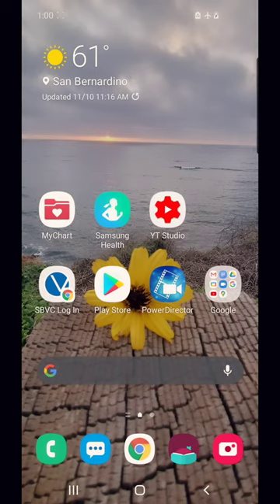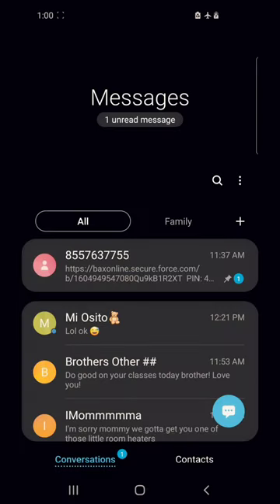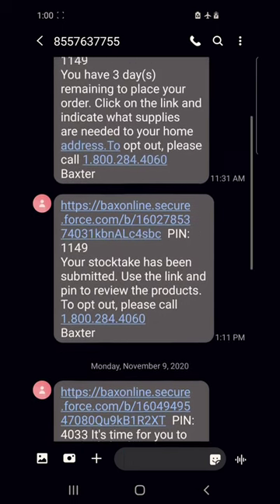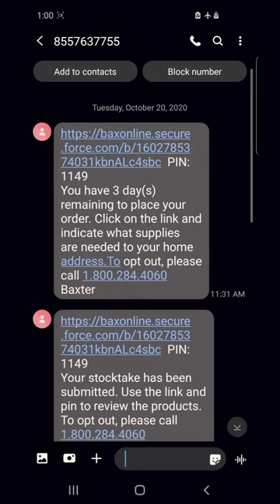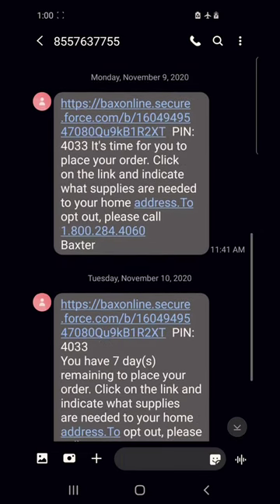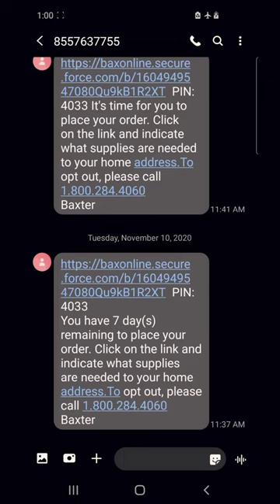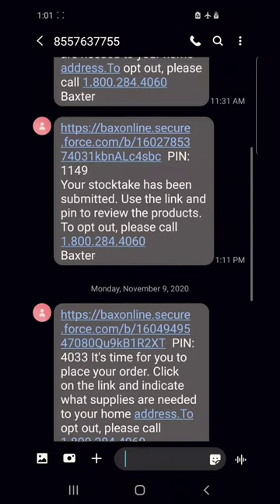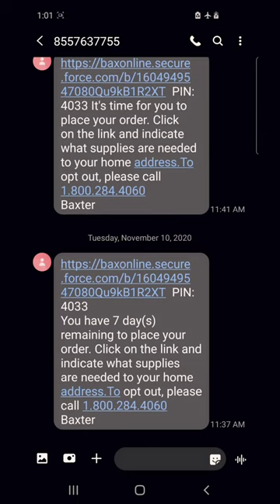When you call Baxter and tell them that you would like this option, they start sending you messages. Like right here, I have a message from yesterday, and these ones are from, I think, last month. They send you messages a week before with the link and the PIN number. The PIN number changes every time you order. It's not going to be the same. See, this PIN is 1149, but this one is 4033. So every month is going to be a whole different number.